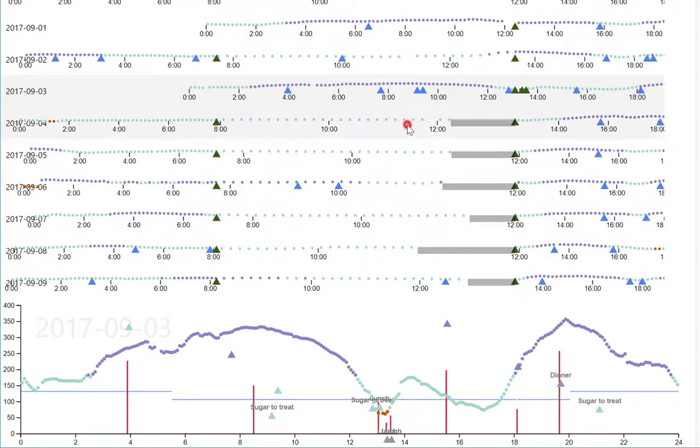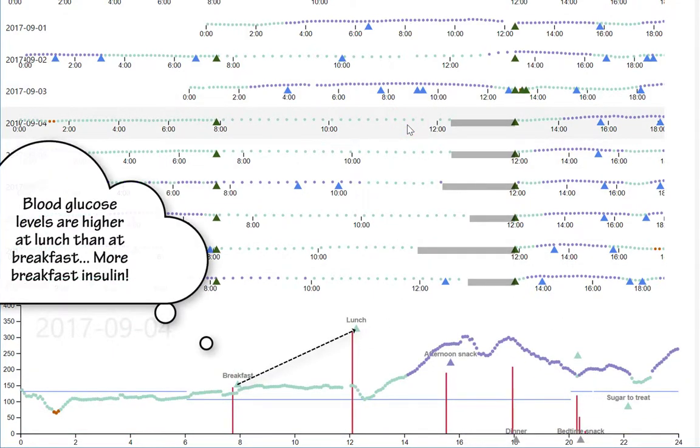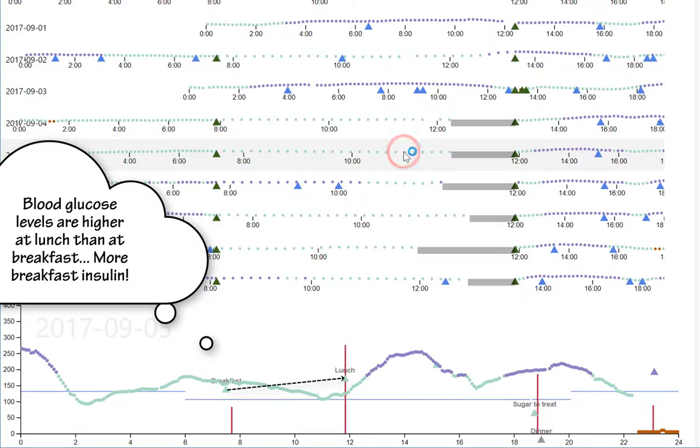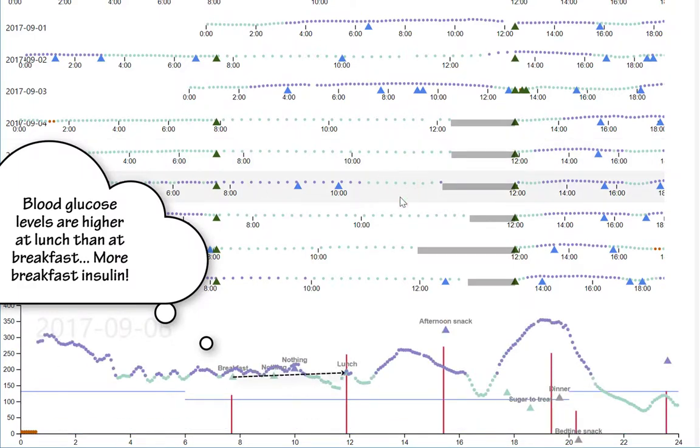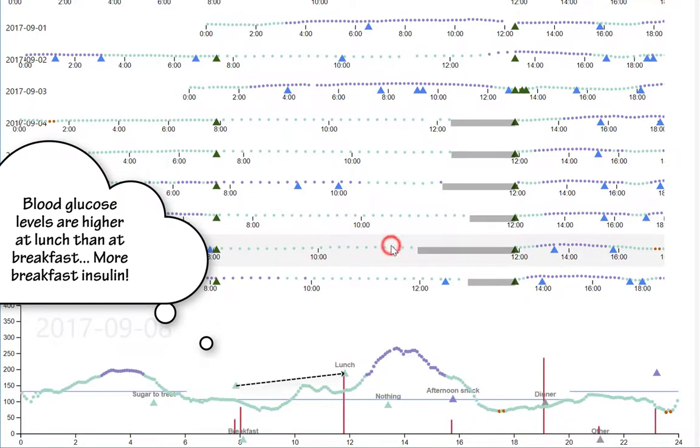Let's look at the breakfast to lunch period in detail for several days. We see that there tends to be a rise in blood sugar between these two meals, so we should adjust the insulin to carbohydrate ratio for breakfast so that we get a little more insulin.